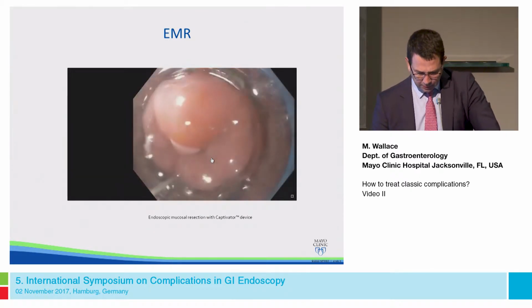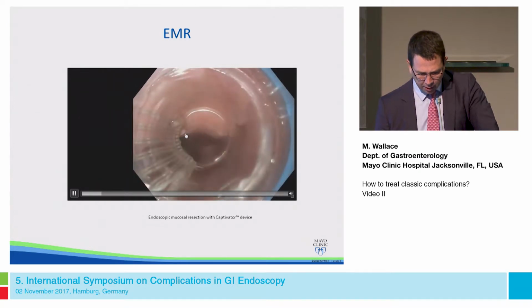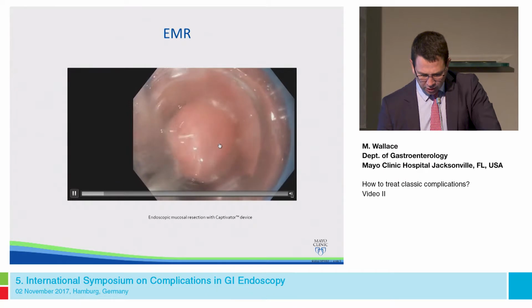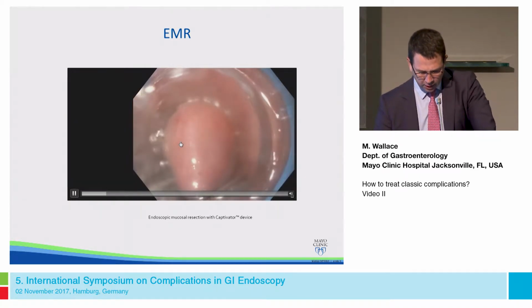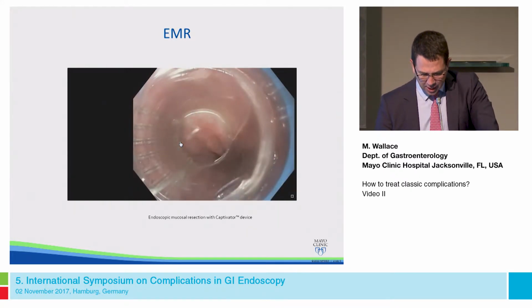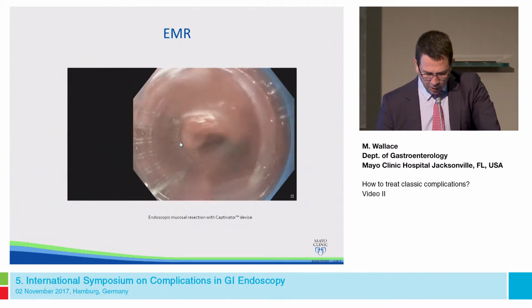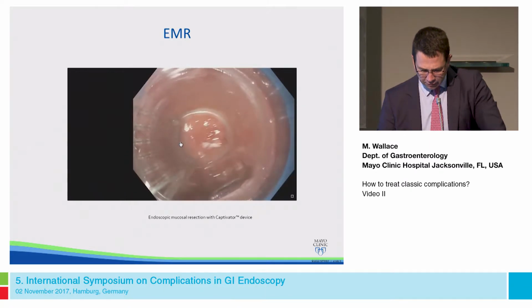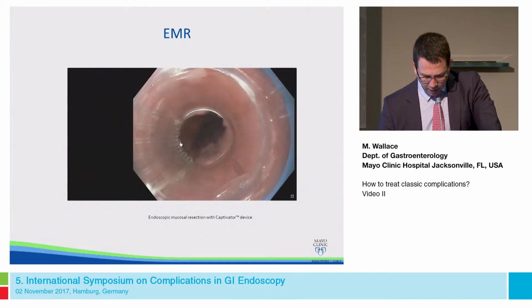And you can see we have some initial problems with the suction. There appears to be some puckering in the area of greatest interest. We're getting the surrounding mucosa, but not the area of greatest interest. To be honest, the fellow was doing the procedure at this time. I was directly observing the fellow, and he was having some difficulty getting adequate positioning of this device and suctioning the area that we were most interested in resecting.